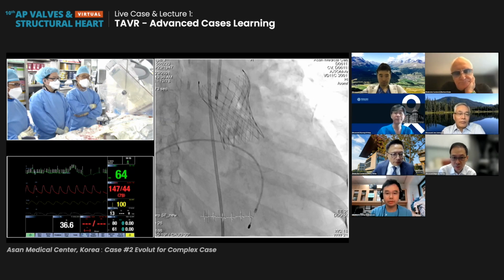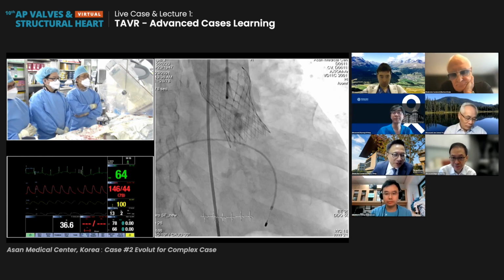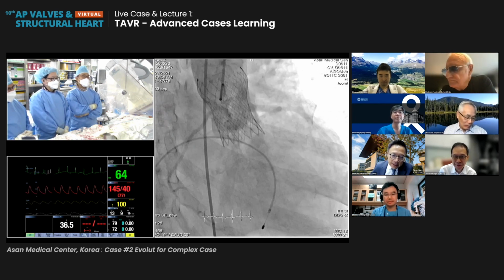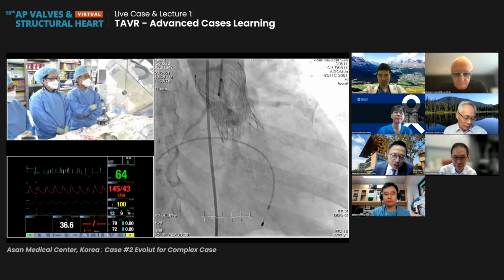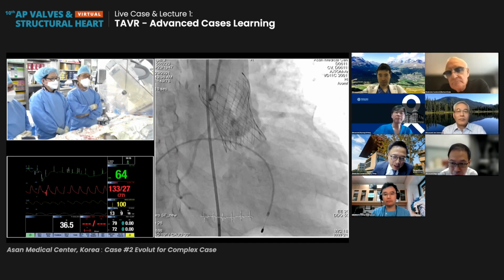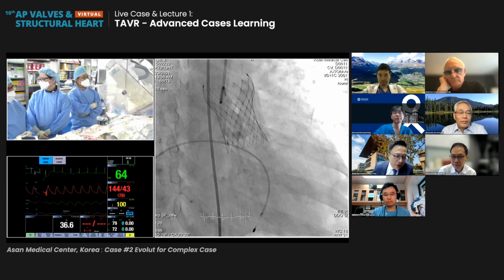Yeah. Thank you. I think this illustrates that when you have a plan, you don't have to listen to the panelists. We always tell you to use a smaller one, this and that, and this looks excellent. If I were going to select the smaller one, there would be many people doing so. Because you look at all the questions about selecting valves and doing the procedures, knowing the details, you measure everything, you know where the gap is, and this 34 actually turns out to have pretty good space in that location where the coronaries are.